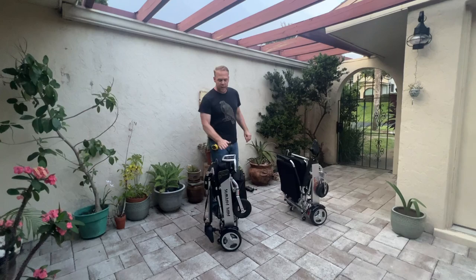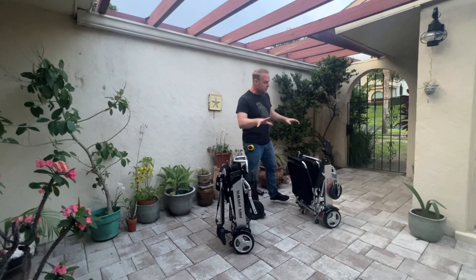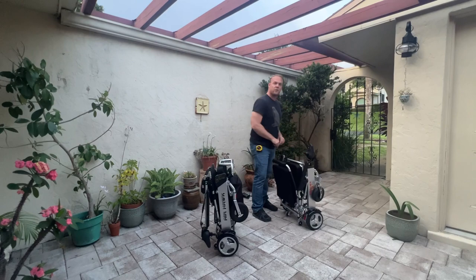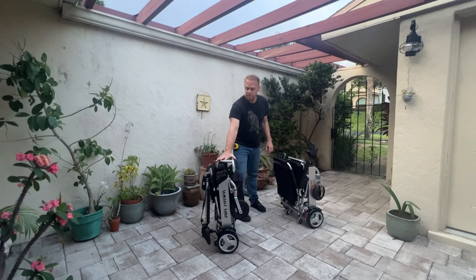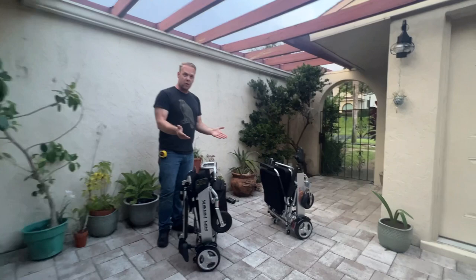The Air Hawk, without the batteries, is billed as the world's lightest chair. It weighs 41 pounds without the batteries, and each battery weighs 5 pounds. So with both batteries the chair weighs 51 pounds — there's only a one-pound difference between these two chairs. They both hold 265 pounds. The Air Hawk has two 180-watt motors, while the Phoenix has two 250-watt motors, so the Phoenix has more power.